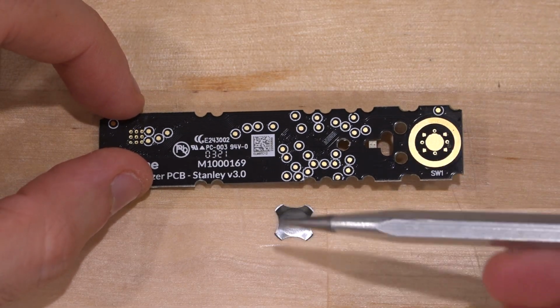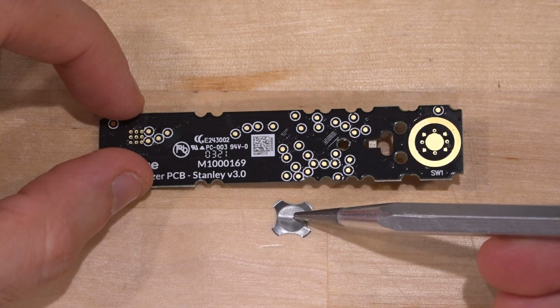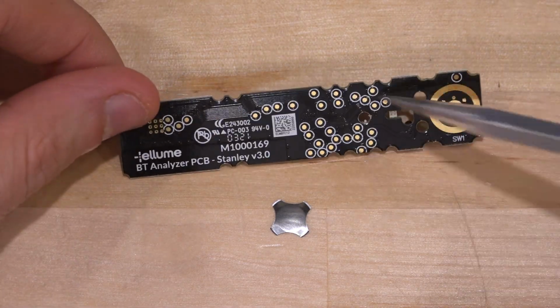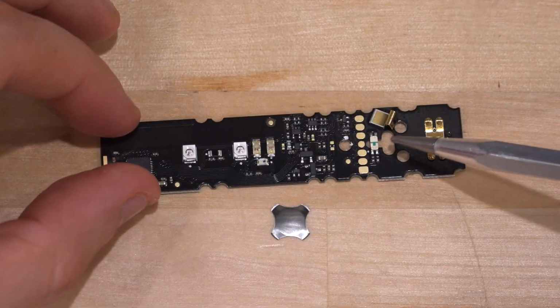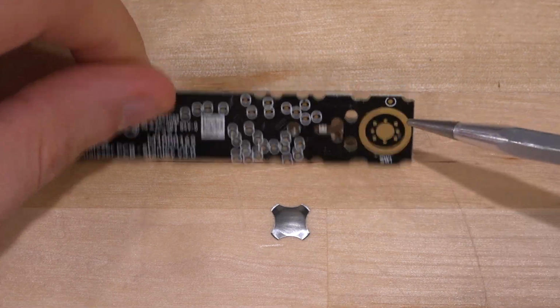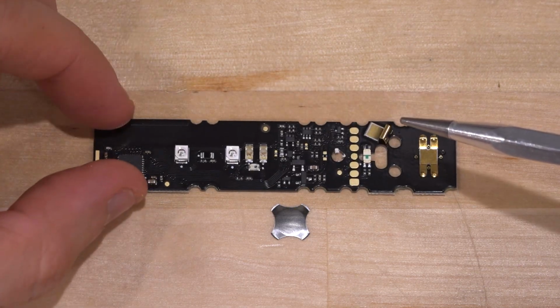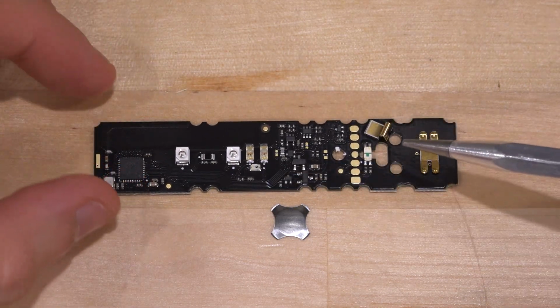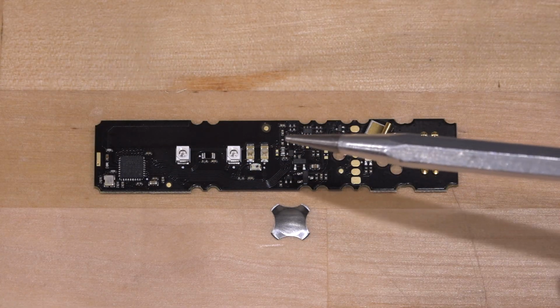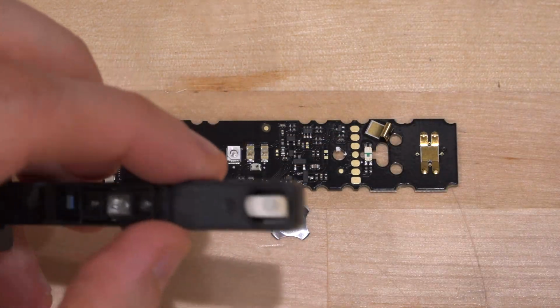These two traces interface with this, that's our button, just to turn it on and off. Quite simple, straightforward. There's nothing else on here, nothing on the back, to reduce the cost, of course. And even the LED for the Bluetooth peeks through from the other side, so there's literally nothing on the other side of the board. Again, we know why, because it's much more expensive to put components on two sides versus one. So there's a lot of LEDs in here, and these different ones obviously interface with different places of this.